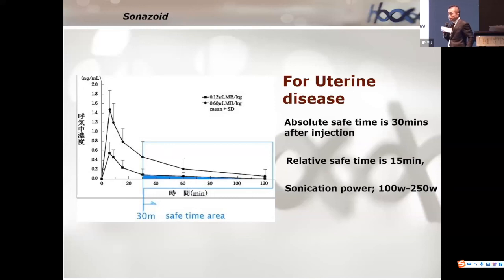And do you have the same results in fibroids with high vascularization compared to fibroids with medium or low vascularization? Is the response different with Sonazoid in one type of fibroid and in other types?